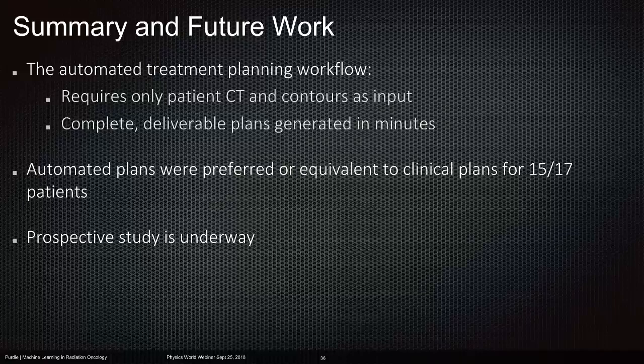And so I think that's a really good place where we will still be able to make a very large contribution. And we can make the systems much more sophisticated to be able to alert us when we see these variations in the input data. And we already do this now. You could also say, I find these patients to be an outlier from this entire group of patients in a database. But someone needs to check that, right? And someone with some clinical knowledge needs to be able to say what's going on. But this is always going to be the case because if we give it the wrong data, we're going to get bad results.